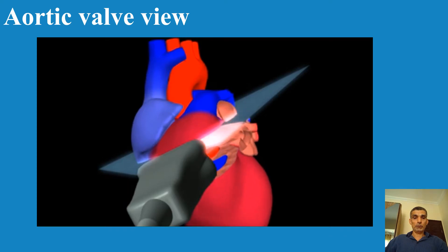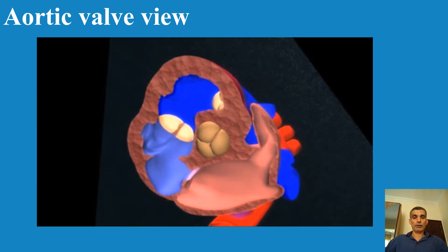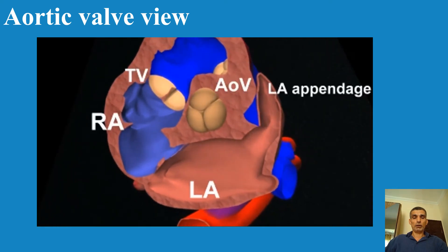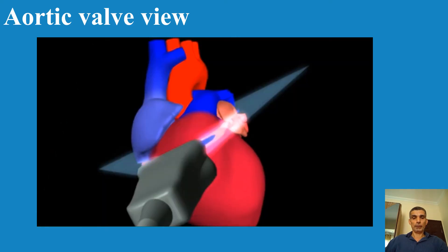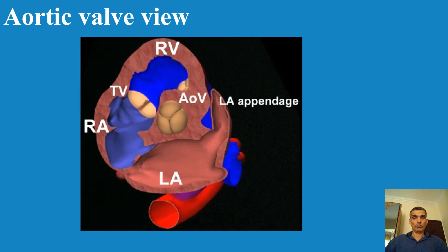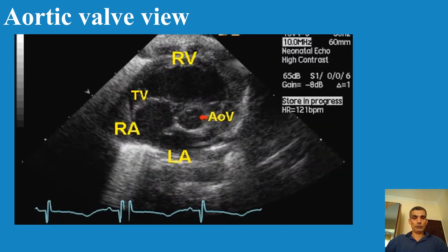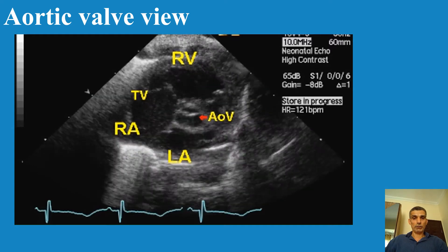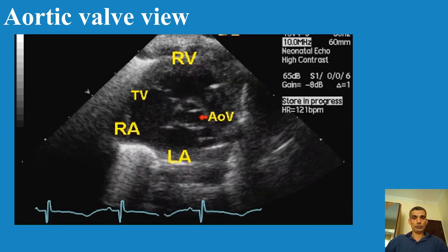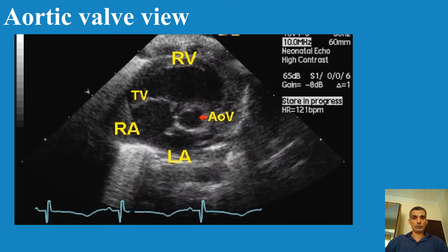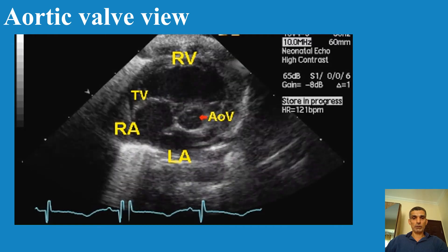In 2D, you see the aortic valve with three cusps, the right ventricle taken from the right atria through the tricuspid valve, the left atria, and possibly the left atrial appendage.